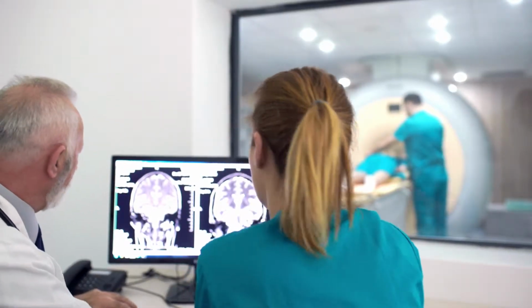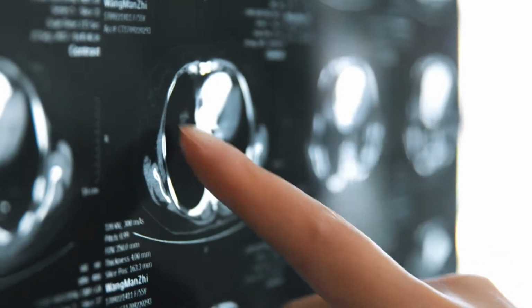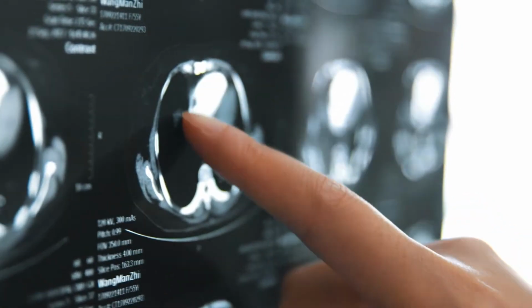One is it's really a three-dimensional technique, so we can actually see details. Regular x-rays are just a projection onto a screen, and so a lot of anatomy overlaps, and you really don't have detailed evaluation of the insides of the body. With MR, it's really a 3D evaluation of the inside of the body.